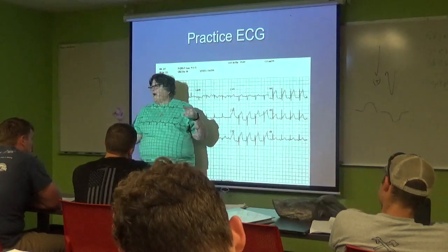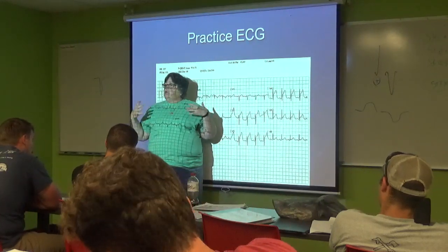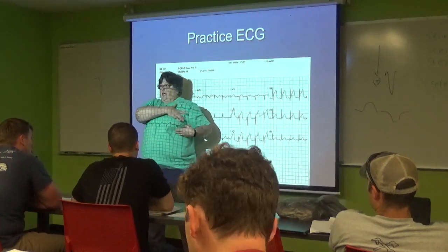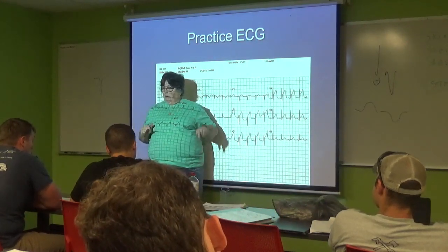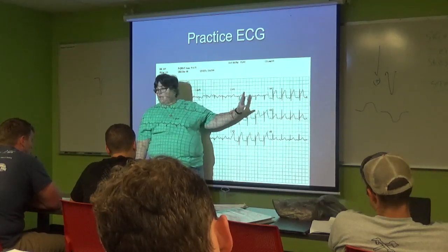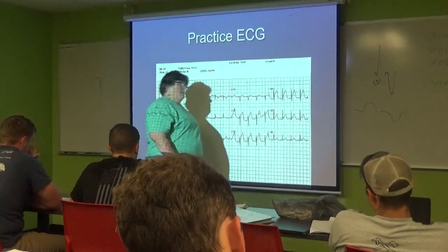You can say it that way, or you can call it anterior lateral with septal involvement, or anteroseptal with lateral involvement. But you're recognizing that the anterior wall is dinged, and it's spreading out to number 2 and number 5, as well as the high lateral portion over here. So you call the MI by an inferior, or an anterior, or septal, or lateral, and then you add the other stuff that you see on there. So this is an anterior lateral with septal involvement, anteroseptal with lateral involvement. Does that make sense? Okay, so let's do another.